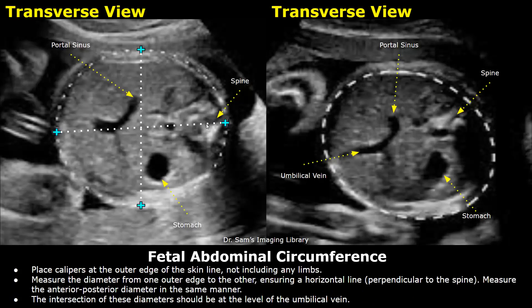Place the calipers at the outer edge of the skin line. Do not include any limbs. Place one caliper just behind the spine and the other caliper at the opposite side. Similarly, place the next two calipers perpendicular to this measurement, and you will get the value of abdominal circumference.